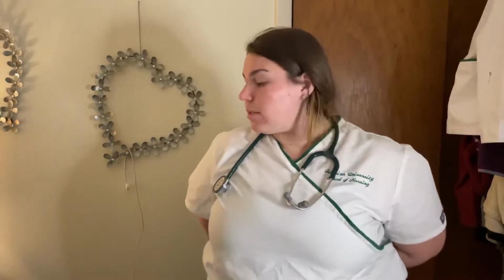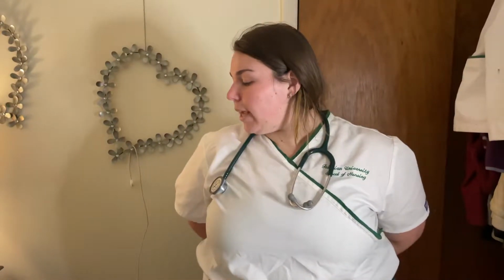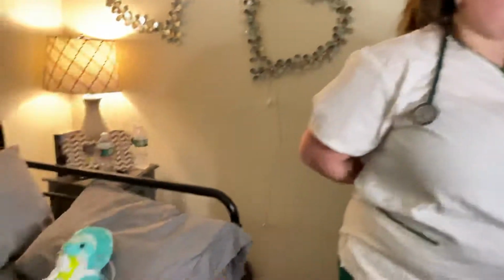Today I'm going to be giving you a video demonstrating trach suction and trach care. This is my patient, Mrs. Gerban. So the first thing that we're going to be doing prior to entering the patient's room is we're going to go through the patient's chart just to look at some of the vital signs and any other information we might need to know about the patient.